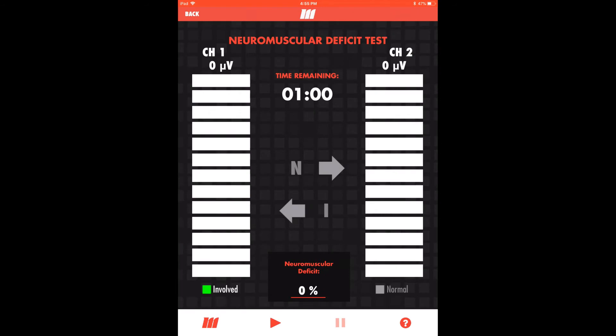Finally, we'll demonstrate the neuromuscular deficit test. The neuromuscular deficit test protocol provides a side-to-side assessment of the EMG activity of the involved side compared to its healthy counterpart in the form of a percent deficit. This test consists of three five-second maximum contractions on the involved side and then the same set on the healthy side.